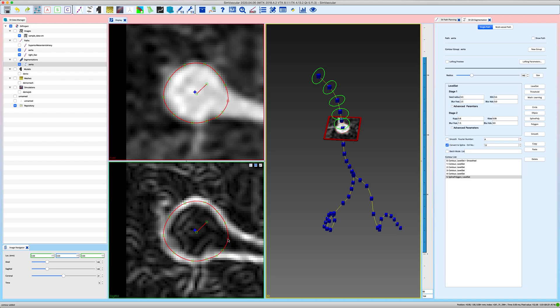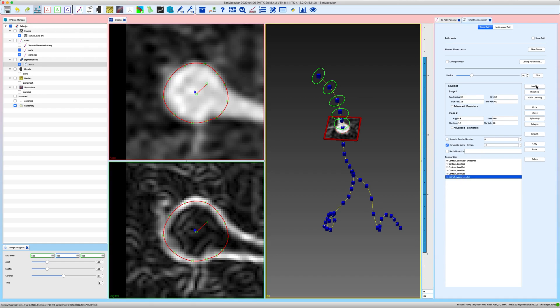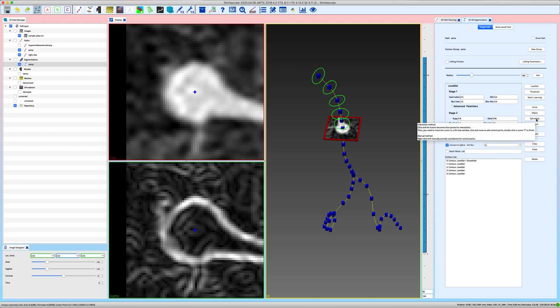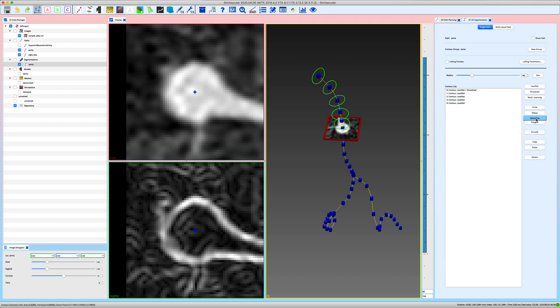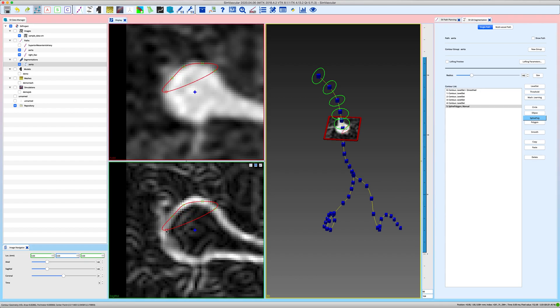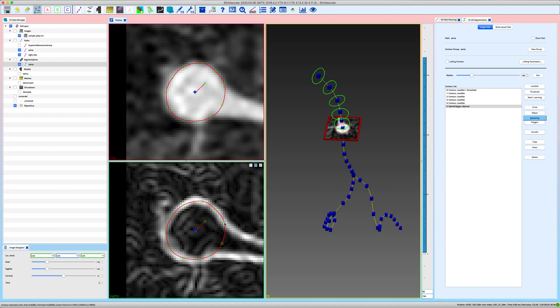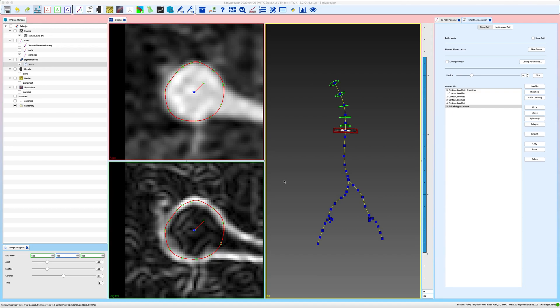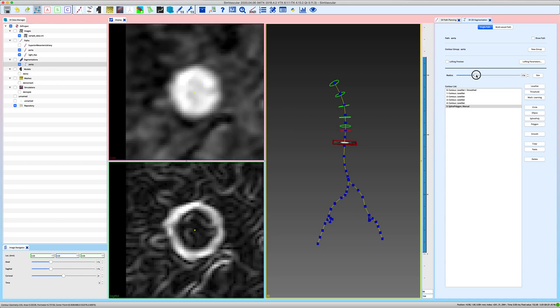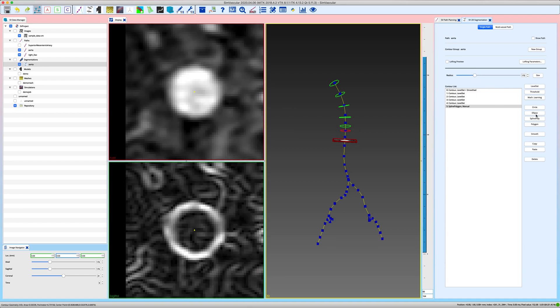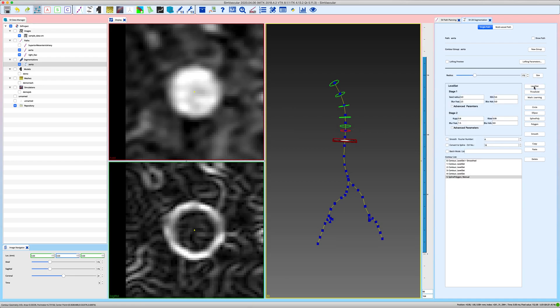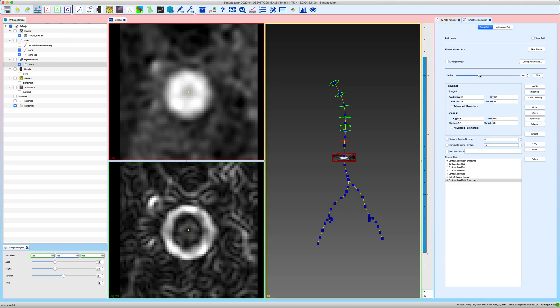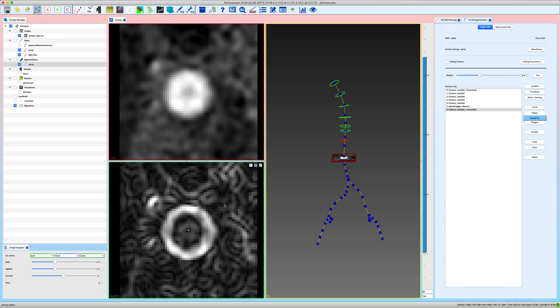And say I'm happy with this one, I can just leave it like this now, or the second option let's go back. Say I have this level set that I don't like, I would delete it, and now I can create a manual segmentation by clicking on spline poly and then with left mouse clicks you just add control points wherever you want them to be. Double click to finalize the curve and this will be your resulting outline. If you want to add more control points just hover anywhere on top of your segmentation and you can add additional control points. And from this point on we can continue with our segmentations along the vessel path either by using the level set method and maybe smoothing it or by creating manual segmentations with the spline poly.